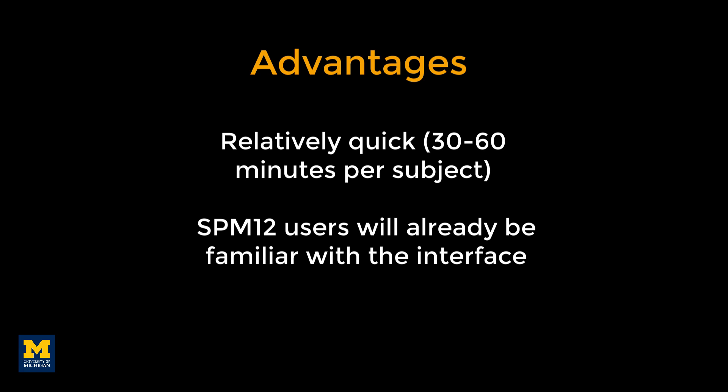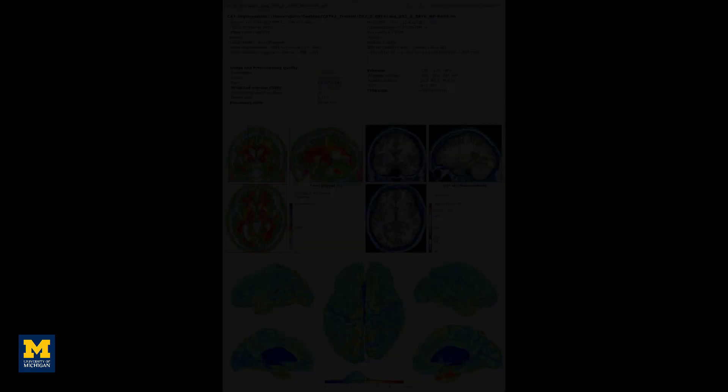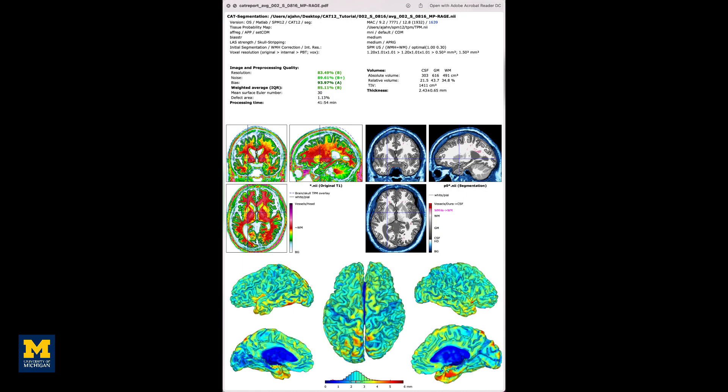CAT-12 also generates useful quality assurance reports in PDF format which quantify, among other metrics, the amount of noise and distortion in the anatomical images. This provides a quick and simple check for whether to exclude particular subjects and can help determine whether the scanner is producing high or low-quality data.